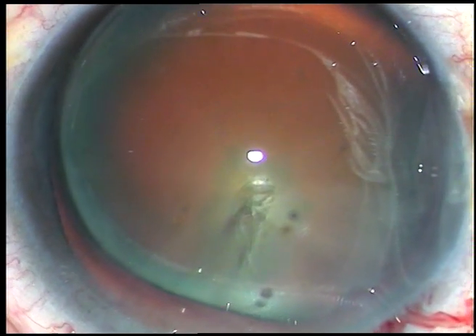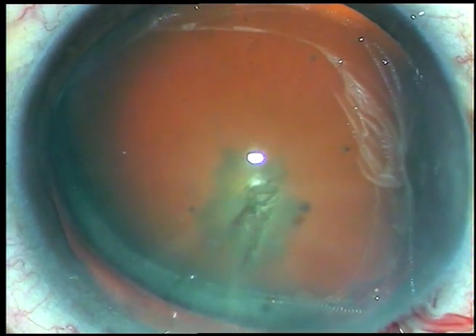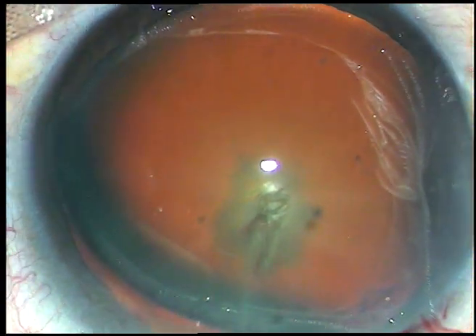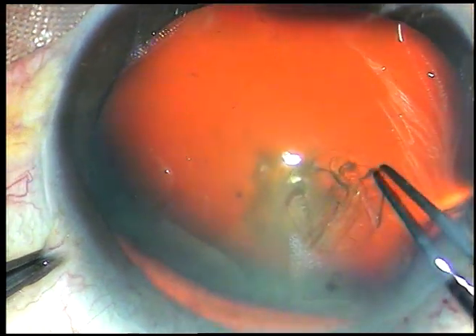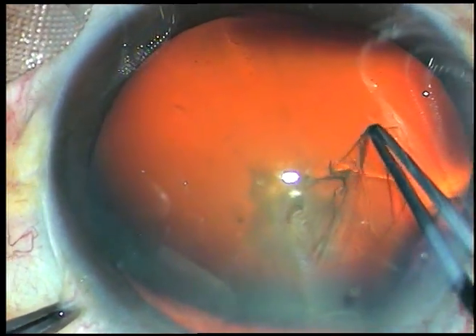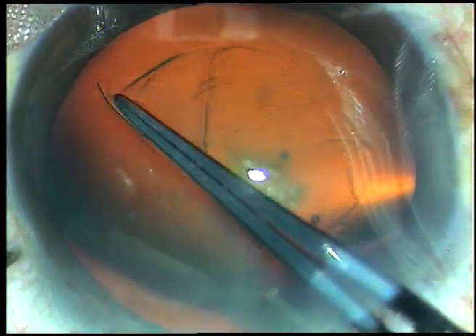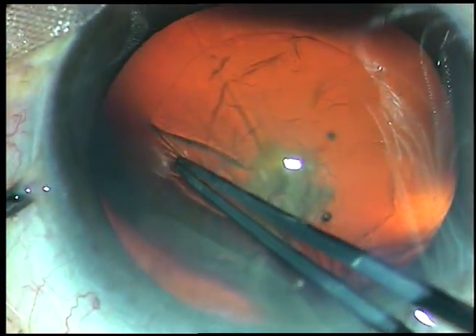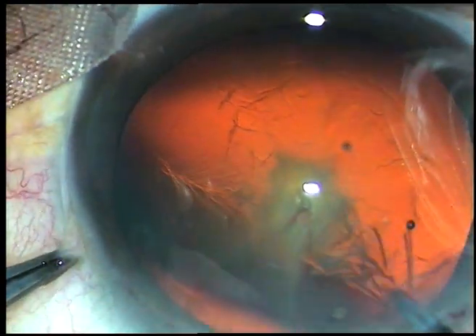You will now be able to see the capsular edge very nicely. I take a utrata forceps, hold the capsular tag, and go anti-clockwise. I remain at a particular distance from the border of the dilated pupil, and thus I get a fairly round rhexis.